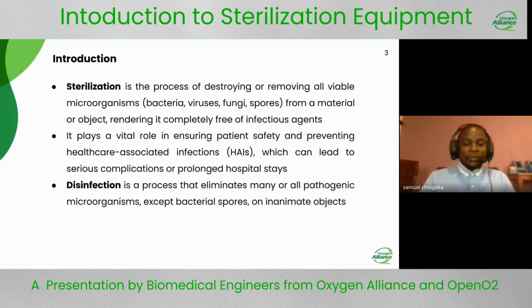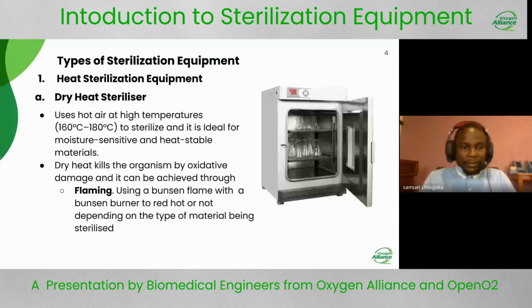So after looking into the introduction, let us dive into our types of sterilization equipment.